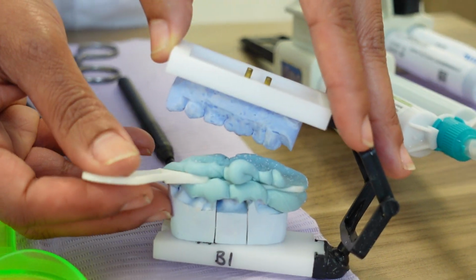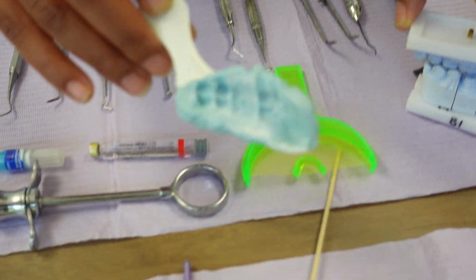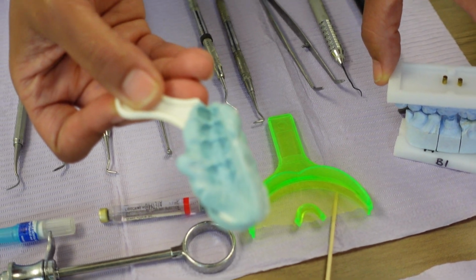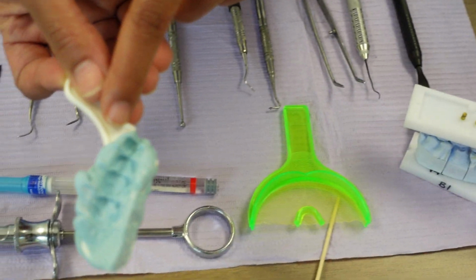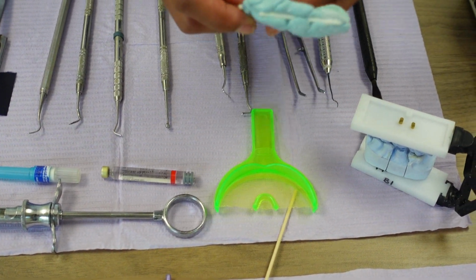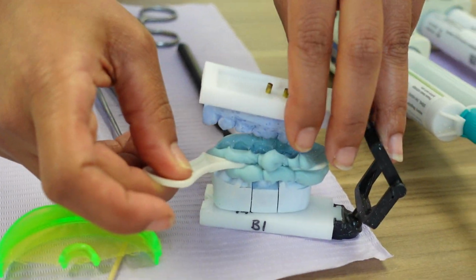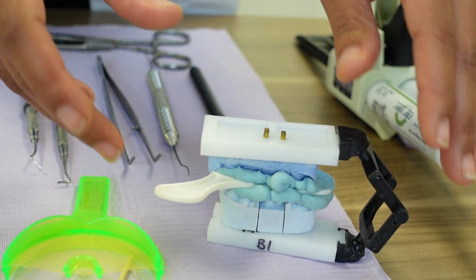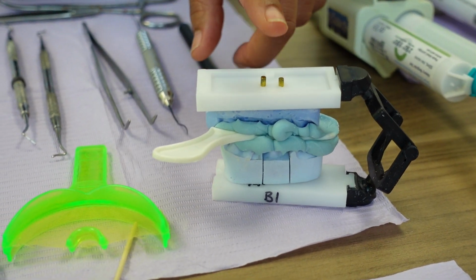Now, listen here. This is what a preliminary looks like when we take it on the patient, okay? Yes, it is clean. I wiped it down and sprayed it, all that good stuff. This is for posterior teeth. Posterior, you see it? Anterior, all right? I want to put this back on because this is usually the final that comes from the lab. See how that occludes? Everything fits great. Usually the permanent crowns come out on that. So we use those all the time for demonstration for students.